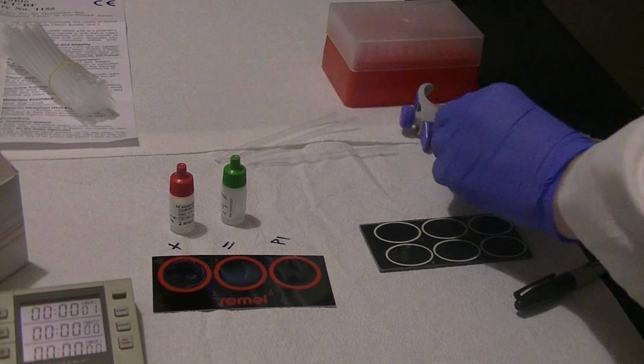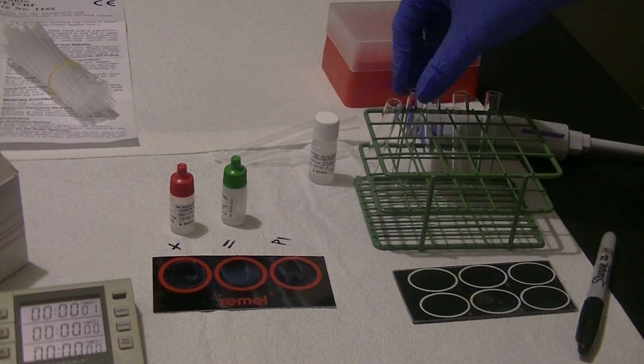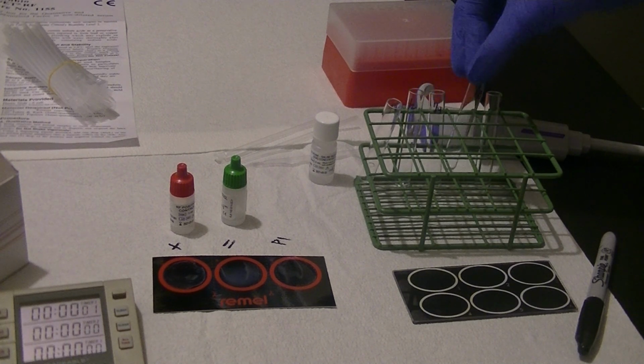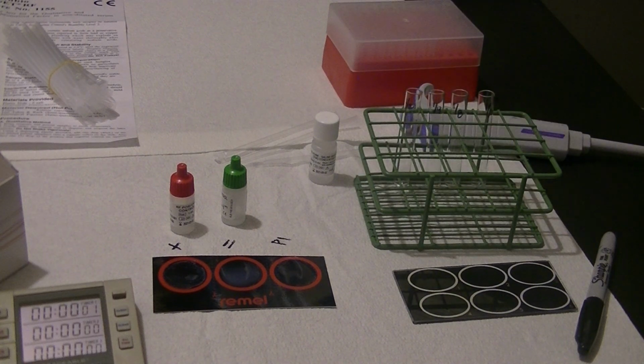So in order to do that, what I have here are some labeled tubes. I'm going to make a 1 to 2 dilution, a 1 to 4, a 1 to 8, and a 1 to 16. So what I'm going to do is add some buffer that is included in the testing kit.